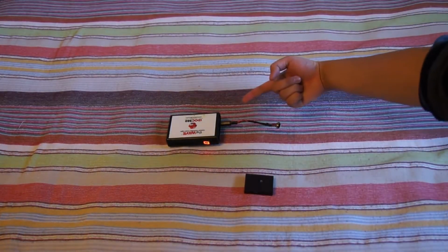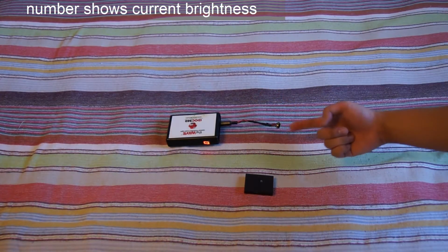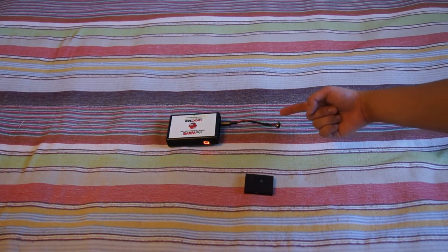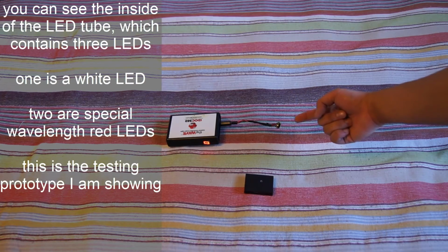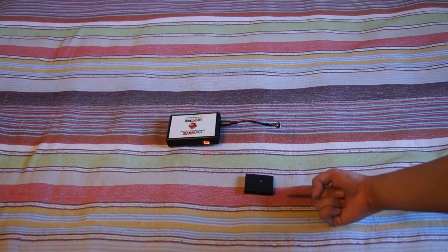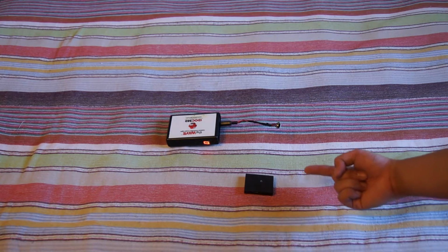This is the main unit. The number that's glowing is a brightness display. This is the LED connected to the main unit, and it's the shorter exposed version just for demonstration purposes. And this is the remote that senses gestures and sends the commands wirelessly to the main unit.